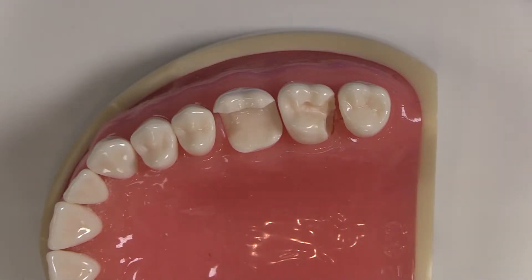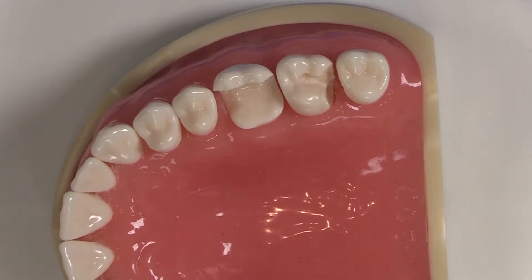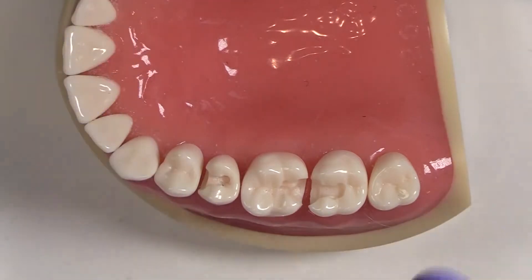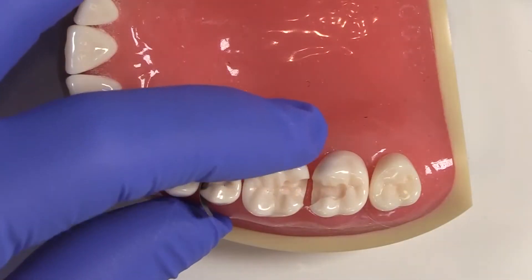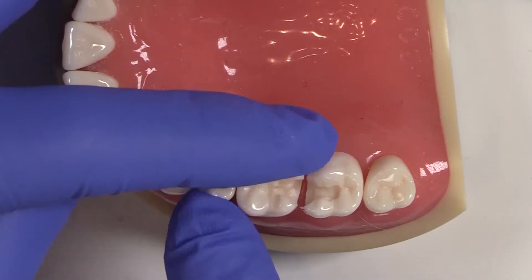My first tip has to do with getting the matrix band in the right position to get the best seal. Lots of times when you place this matrix band in — let's look at this tooth right over here — the gingiva prevents us from getting the band all the way down. I place this in here and I have the matrix band bumping into the gingiva on the palate and on the buccal.